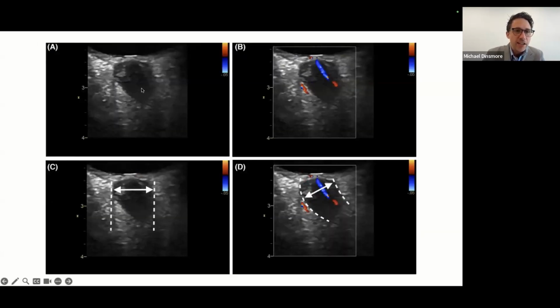So if you look at A, you can kind of convince yourself there's two perpendicular lines going straight down the back of the picture there. And if you look at C, often before, a lot of papers would actually measure this distance going straight down. This probably overestimates the size of the optic nerve sheath. And you can see why.